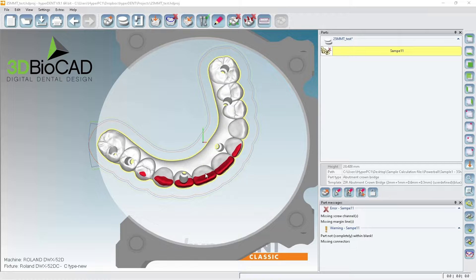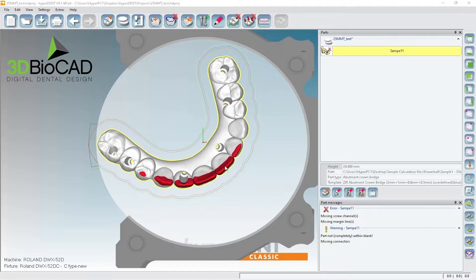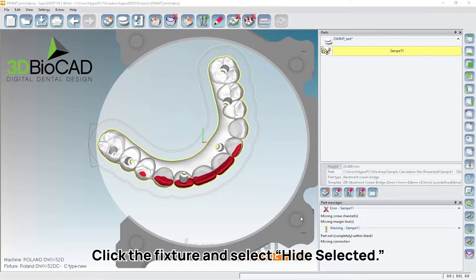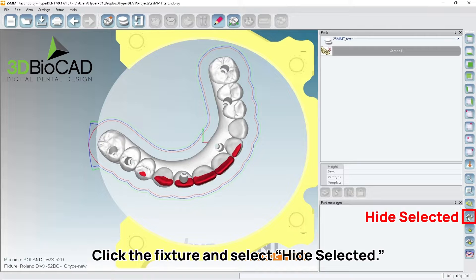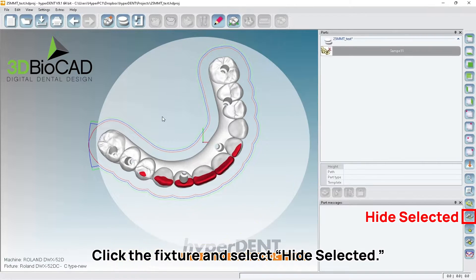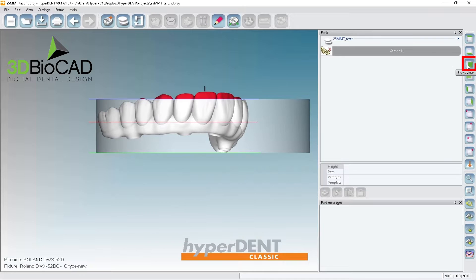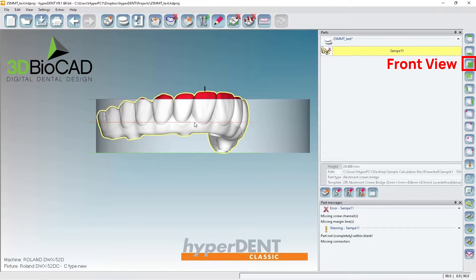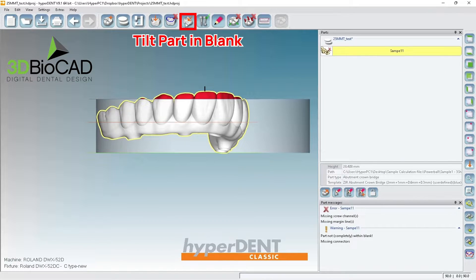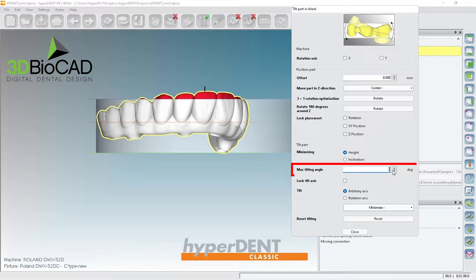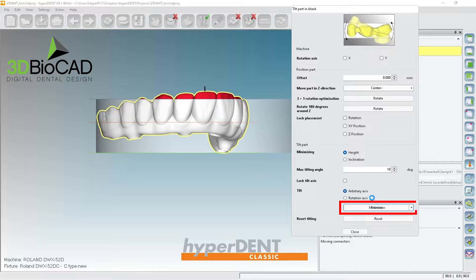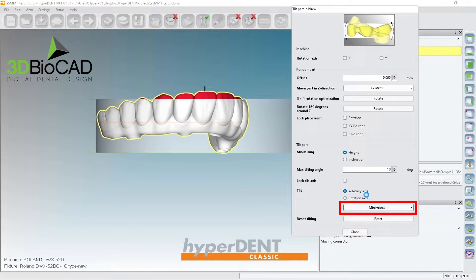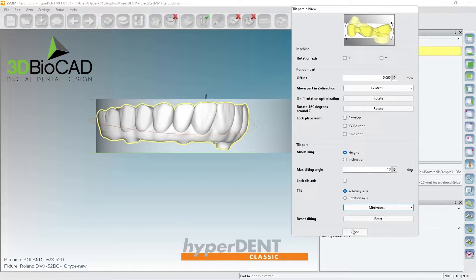Alright, so now we have the file. You can see the red, meaning I'm going to select the fixture again and hide selected just to get rid of it from view. So let's go ahead and tilt it. I'm going to tilt it, let's do 10 degrees. It's just a random number that I like. It looks pretty good, so let's close it.